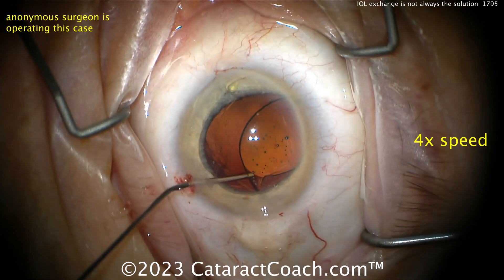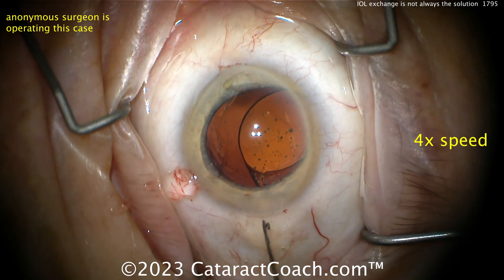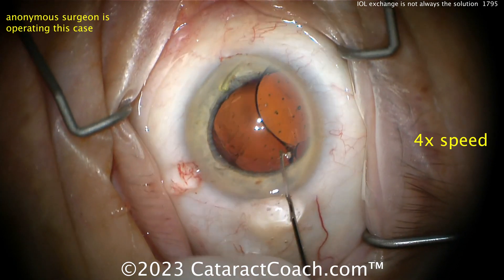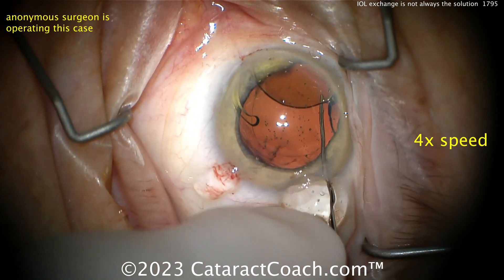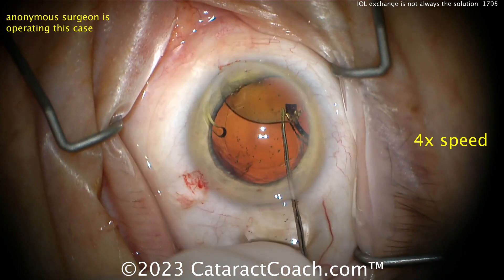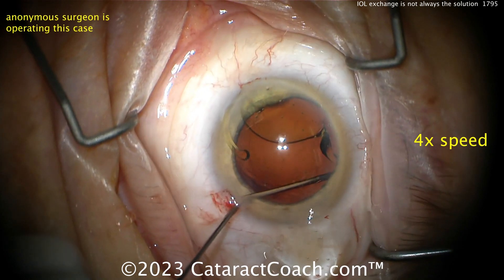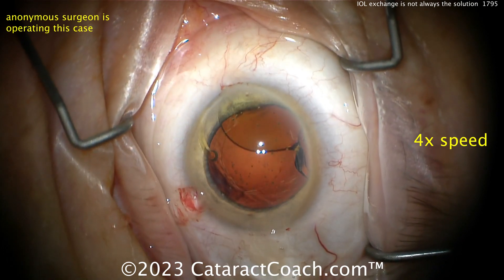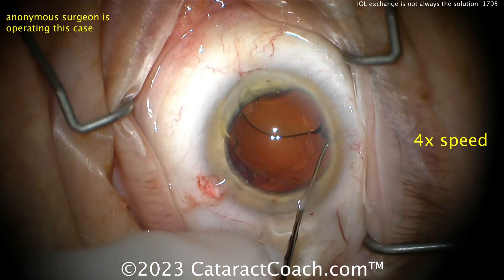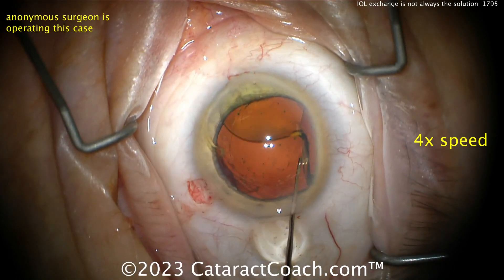I'm watching the video for the first time with you — we watch this together, we're a team. Now dissecting that other haptic up; it's a little stuck. I'd be more cautious, I wouldn't pull so hard — I'm afraid of breaking things like zonular support. More viscoelastic, that's a good move. You want to be gentle getting that off because with this Alcon lens that had a bulbous tip.